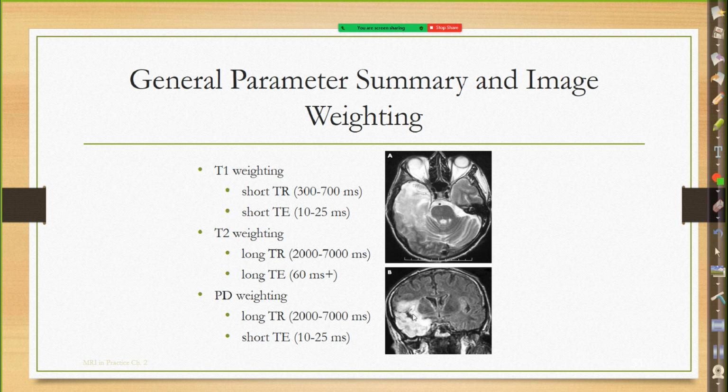It's probably the same patient here. And then fluid in the ventricles, is that bright or dark? Dark. Okay. Well, it's not completely black. It might look gray, but it is dark in the realm of MRI images. So that is a T1. So first one is T2 up top, T1 down below. Oh, okay. And this is actually a T1 with contrast because the pathology is lighting up too.